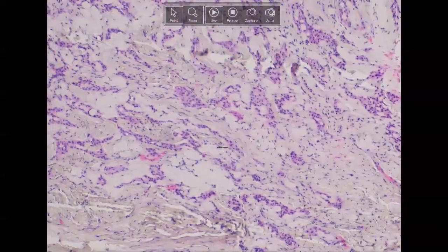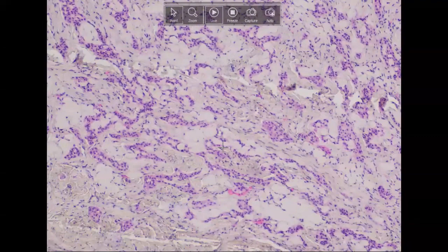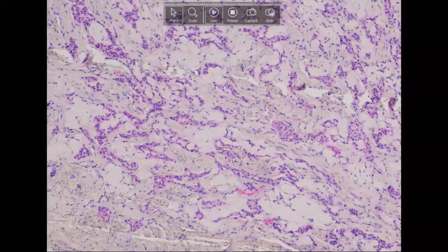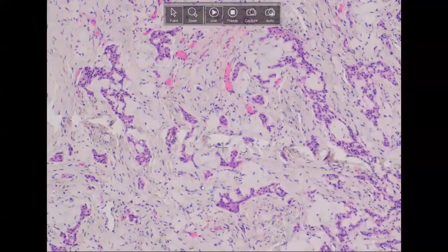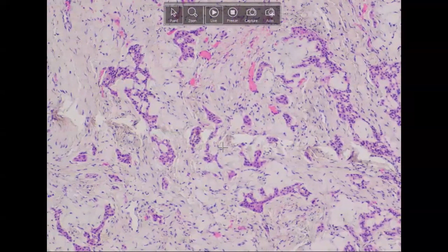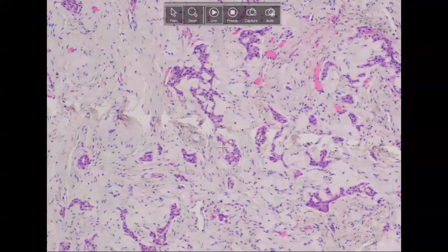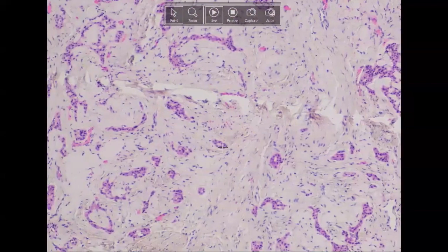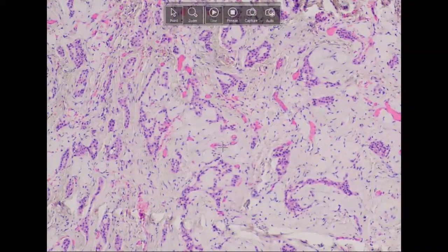I can't emphasize this enough — this is not a common entity at all. It should not be at the top of your differential, but it definitely exists, just like zebras exist. This is a good example of the histology: amyloid-like material as well as more cuboidal pink odontogenic epithelial cells similar to the stratum intermedium of a developing tooth. Half of these are associated with an impaction, but as in this case, they don't have to be.